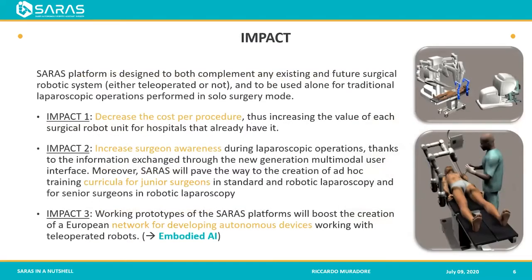The impact of SARAS, if we succeed in our objectives, is quite important, because you can decrease the cost per procedure, because you actually have just one surgeon in the operating room instead of two. Also, we can increase the surgeon's awareness about the procedure, because you can provide further information over the procedure in the Da Vinci console. And then we can develop what is called nowadays embodied AI, a fully embodied AI system. So a system that relies on an AI subsystem to understand what's going on, but also to make decisions, and then to act on the environment. So in our case, moving laparoscopic tools mounted on a robotic arm.